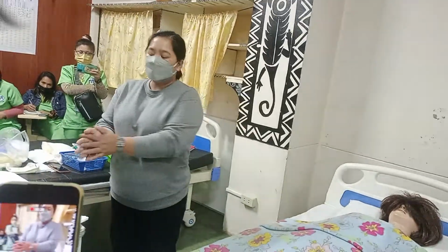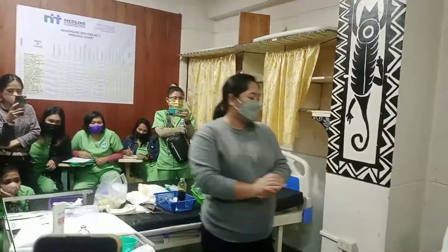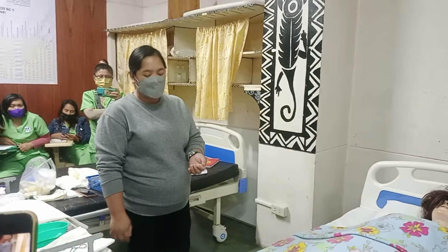Okay, so I will sanitize my hands. I have read the doctor's order. I will sanitize my hands. I will go to the patient.